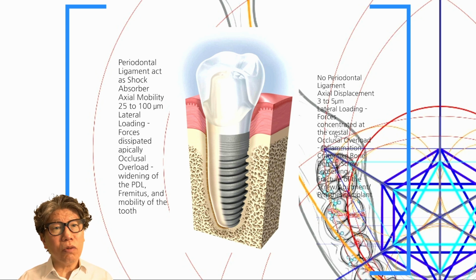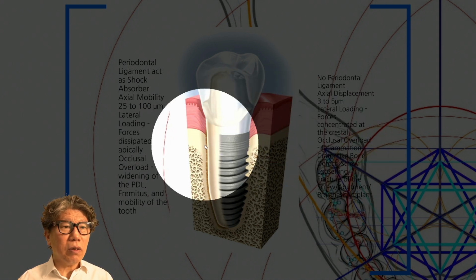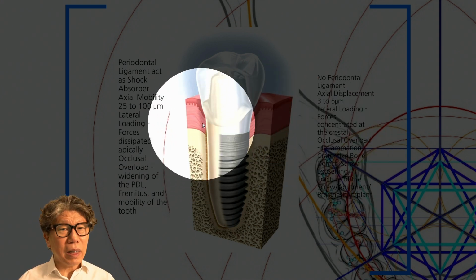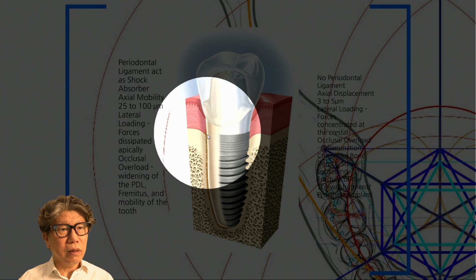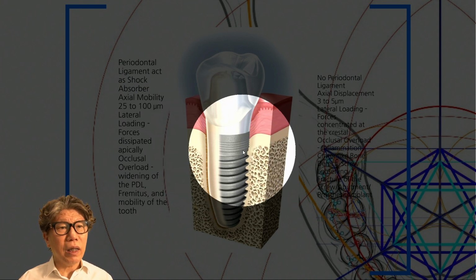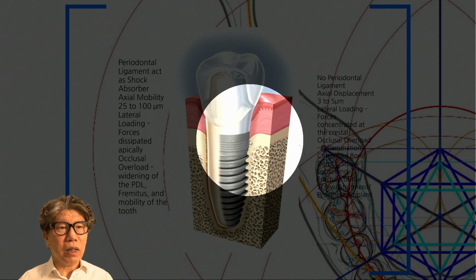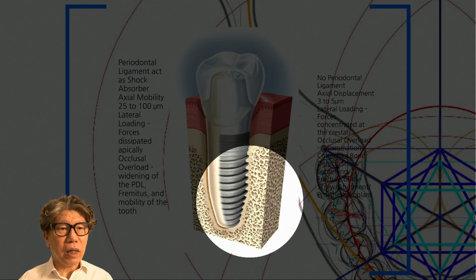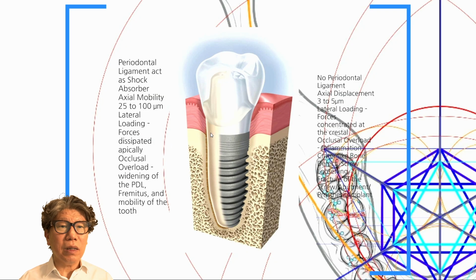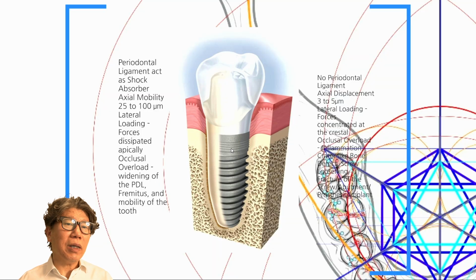Therefore, according to the papers, if occlusal force is applied and overload occurs, the periodontal ligament widens or is stretched. The periodontal ligament serves as a stress absorber in the end. Since the implant does not have this function, crestal bone loss occurs immediately. And once this starts to dissolve, it goes down continuously. Eventually, the implant undergoes a process of loosening. And when stress is applied, the screw loosens and ultimately abutments or fixtures often break.